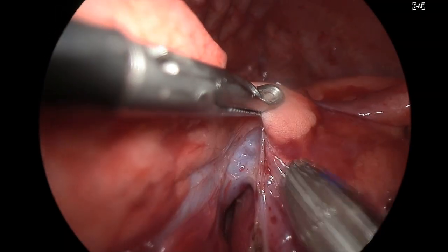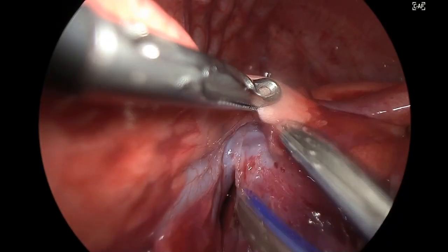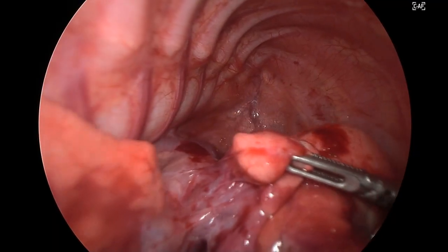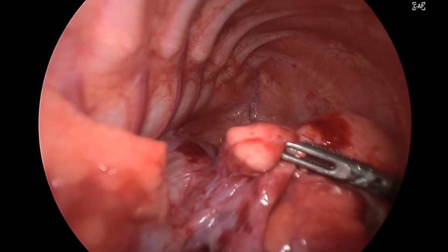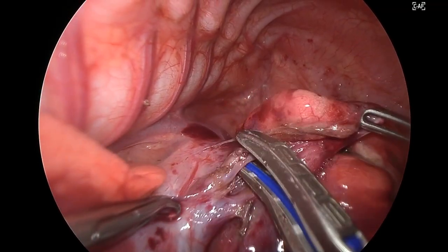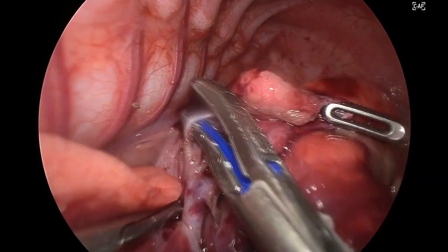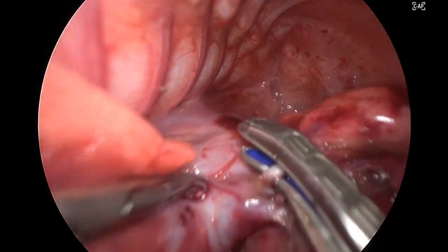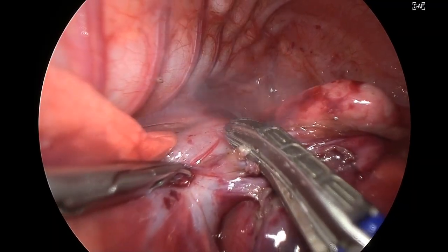Probably because of this cyst the anatomy was rotated, and here what we can see after removing this lung tissue are the tributaries of the superior pulmonary vein that we usually encounter first if we go from the anterior side. But here, maybe because of rotation or some aberrant anatomy, it is right over the area before we approach the bronchus.